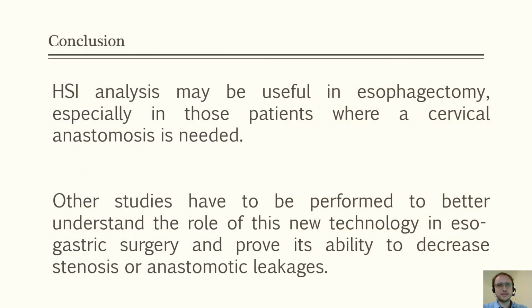Although this is just a first experience, hyperspectral imaging analysis may be useful in esophagectomy, especially in those patients where a cervical anastomosis is needed. Of course, this is just a first case, and other studies have to be performed to better understand the role of this new technology in esophageal surgery and provide its availability to decrease postoperative complications.